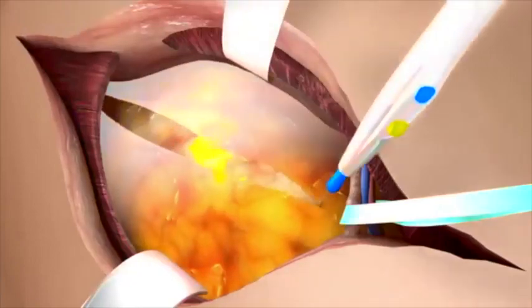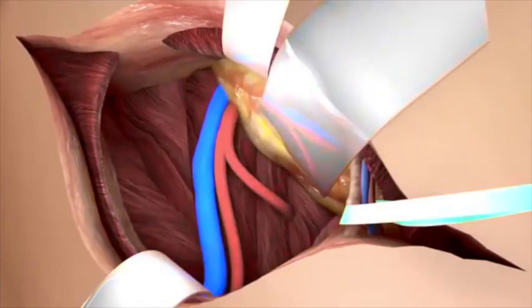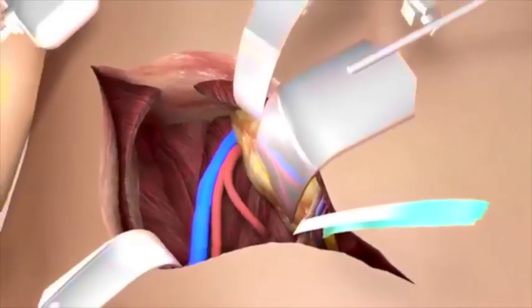The lowest part of the posterior rectus sheath is incised. After this, the retroperitoneal space is reached by gently pushing away the peritoneum, and its contents are held by a retractor. The common, external, and internal iliac artery and vein are identified and dissected from fatty and lymphatic tissue to make clamping of the vessels possible. The iliac arteries are investigated by palpation for atherosclerosis.